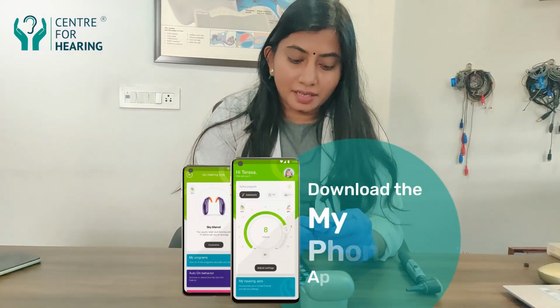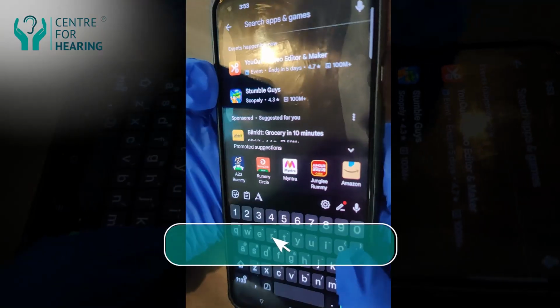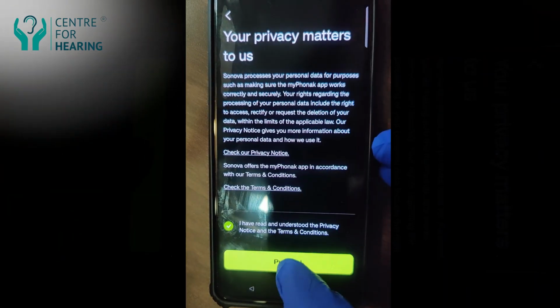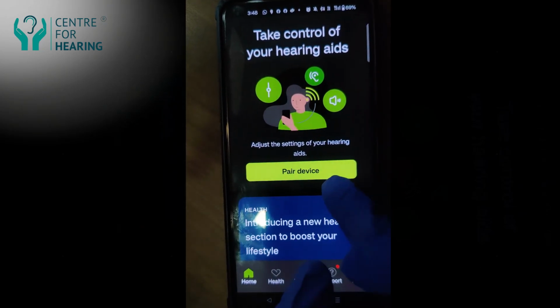The MyPhonak is the application. You can go to your Play Store or App Store and just type MyPhonak. Go to the app, accept these conditions and then proceed. You will find a screen where you can see an option called pair device.